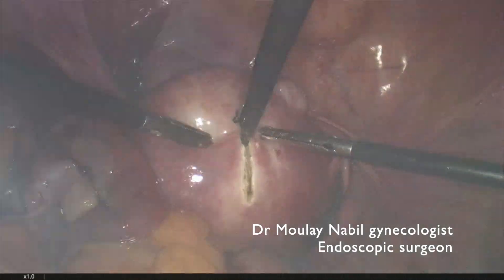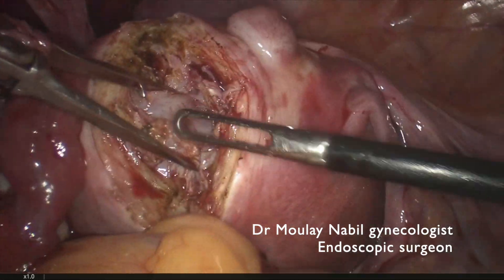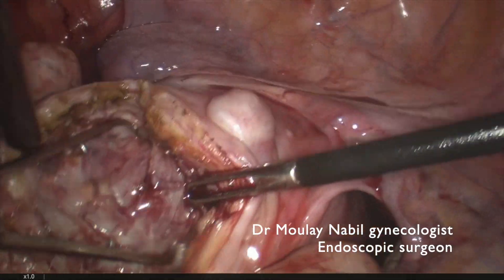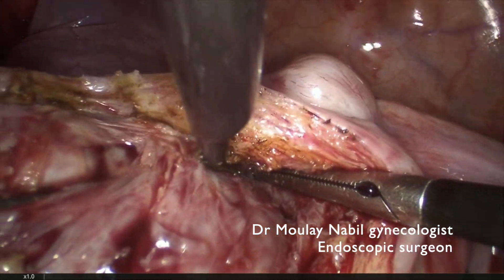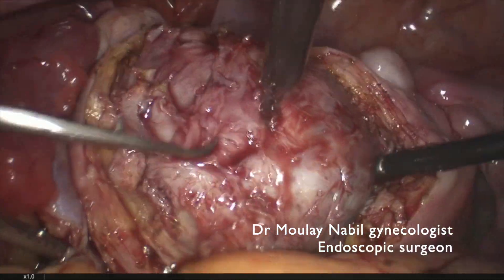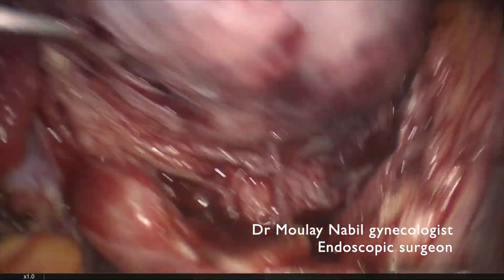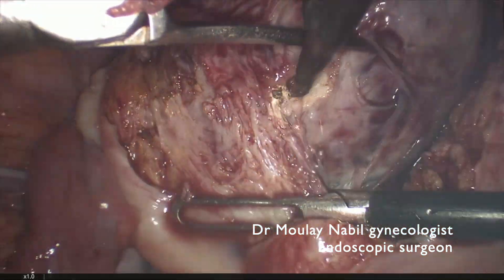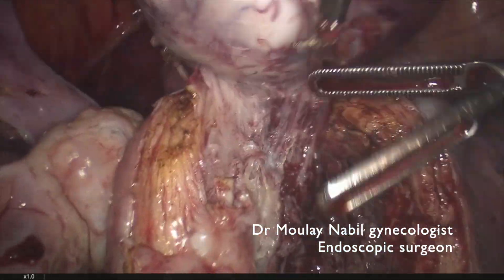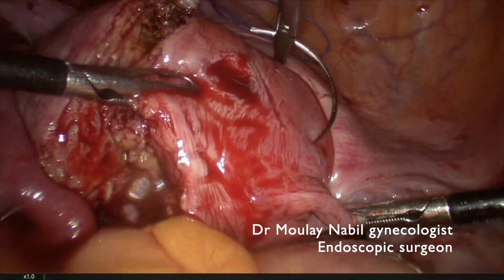Now we will remove a second myoma — it's a 6 cm type 2-5 myoma. We open the myometrium and we will use a 10 mm tenaculum forceps to extract this myoma outside the bed. This myoma has endometrial repercussion — you will see the endometrial cavity — and we try not to use electrical energy near the endometrium to decrease the risk of postoperative synechiae. It's mandatory for this kind of patient to do a hysteroscopic exam two months after surgery.